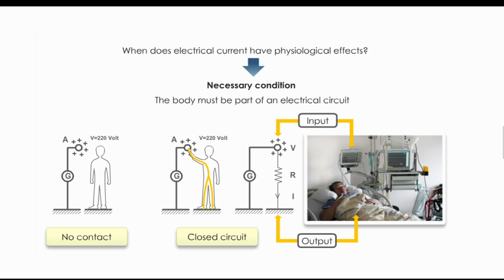However, the moment he touches that, this fault could be from anything really. It could be poor grounding of electrical equipment, misuse of medical electrical equipment, or damaged wiring of a plug, which is a very common one. If there's an open live wire in that wiring, that could be a potential contact.